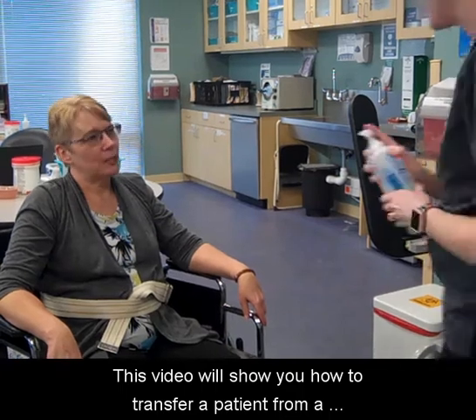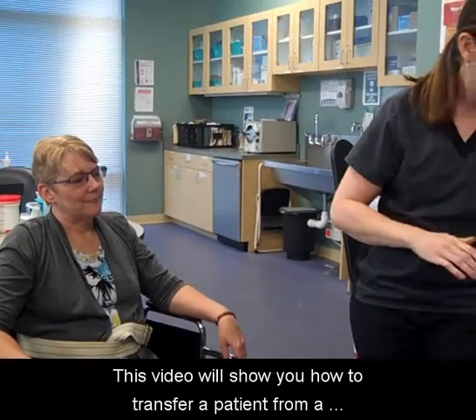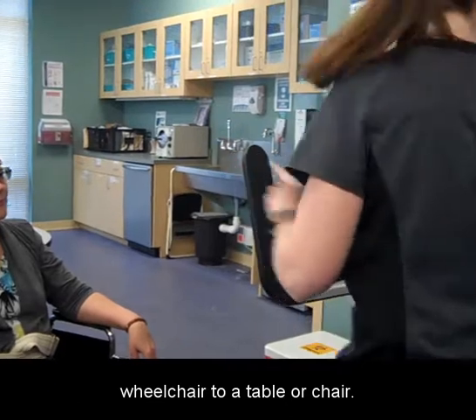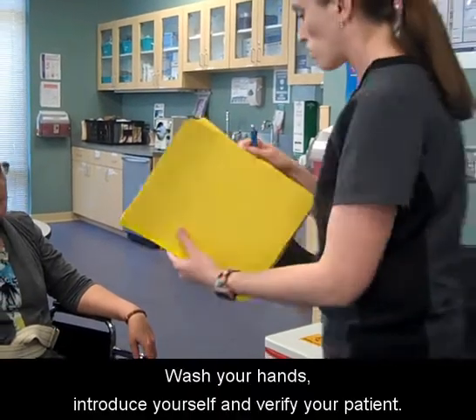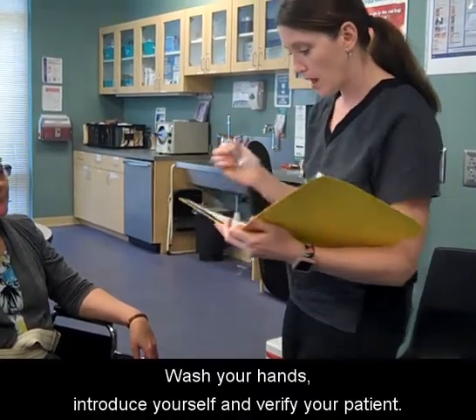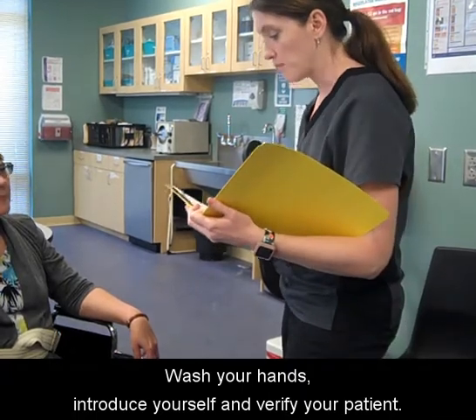This video will show you how to transfer a patient from a wheelchair to a table or chair. Wash your hands, introduce yourself, and verify your patient.